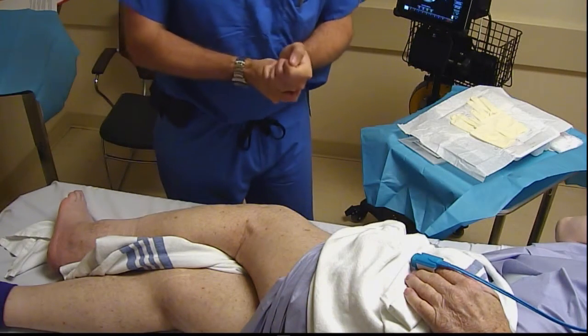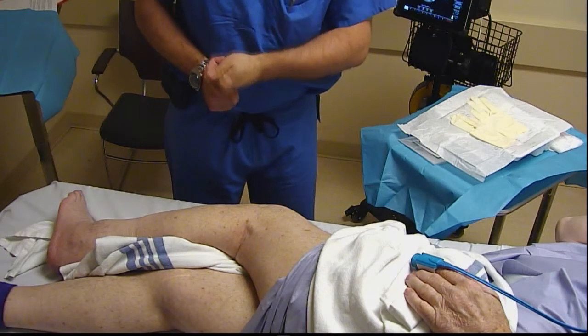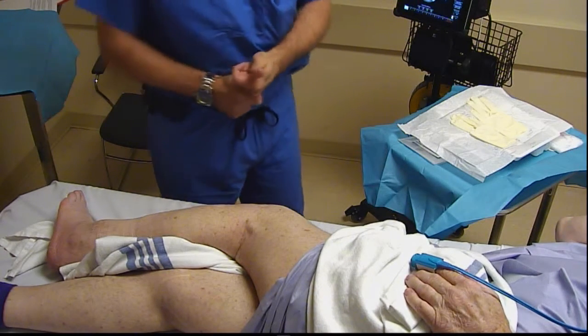Today's block of the day is going to be a left-sided popliteal sciatic catheter with ultrasound for a revision arthrodesis of the left ankle.